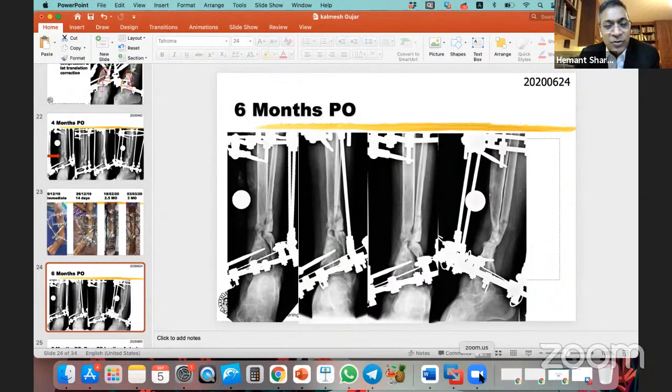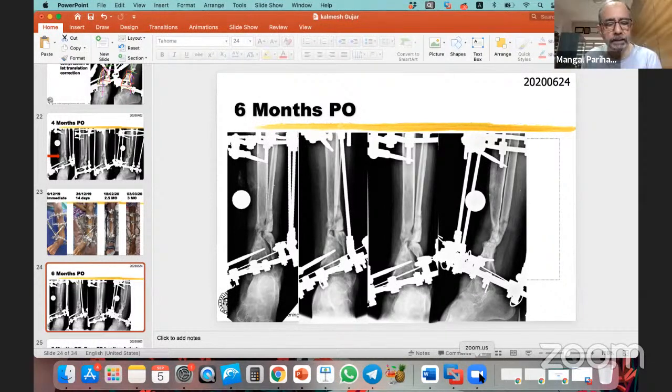I generally worry too much about when the small fragment is there. Yogesh, just one sec. Sorry, just stop sharing the screen, please. Yeah, thank you. Go on. So I worry too much about small segments, and when they haven't walked that much, that bone may be a bit osteoporotic, and my hold may not be good. So I always, as a default, will take support from the ankle just to increase my stability for the distal segment. But you managed it very well, and I think so.